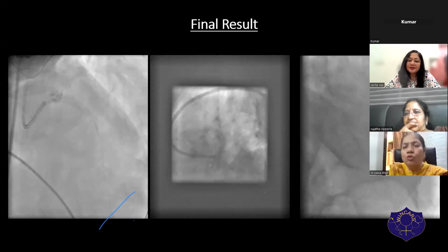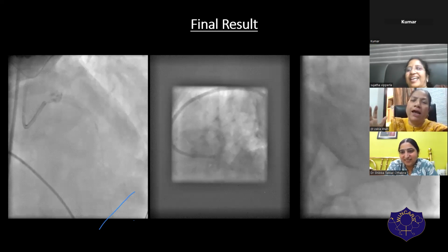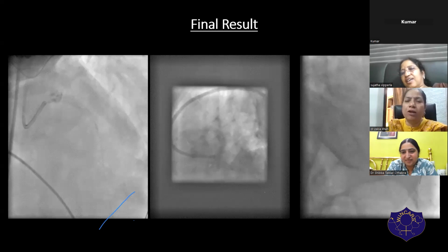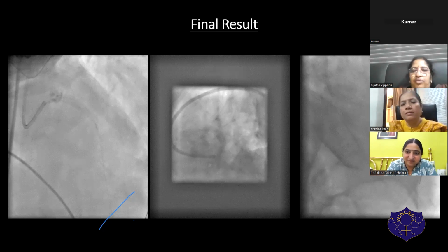Sarita, your left main was roomy. I would still prefer to come in the left main. I don't think your LCX would have got compromised. Going over the left main to LAD is easier, and future results are better than with bringing left main to LAD. I feel nothing would have happened to your LCX. Your LCX is fine, and you will be able to access it better in the future, and your ostial LAD preparation would have been much better. You would have come more into the left main and prepared it much better, is what I think. But in the end, result is very good.